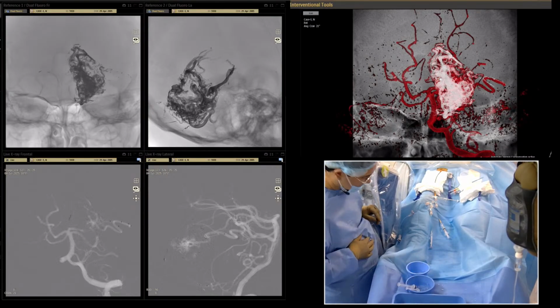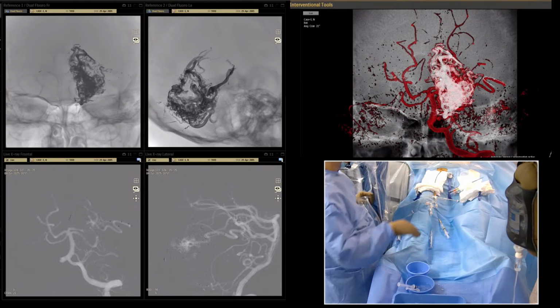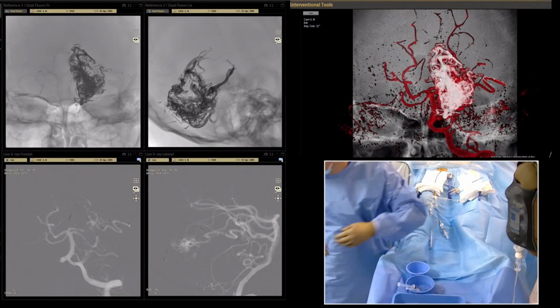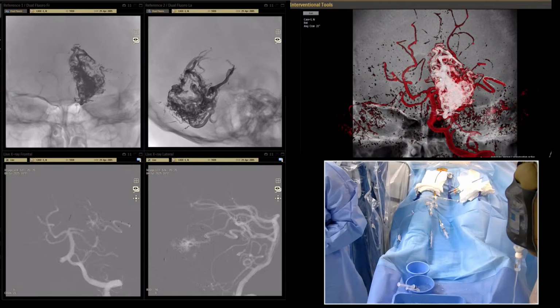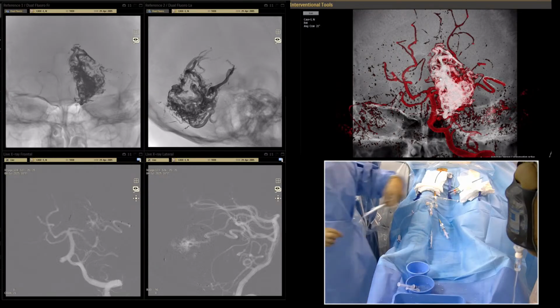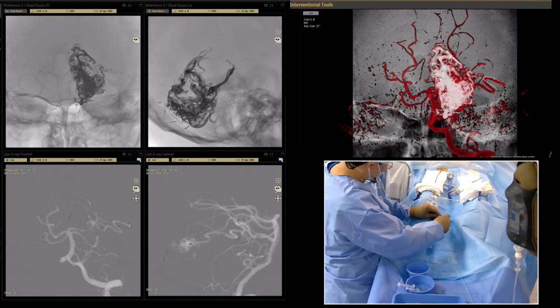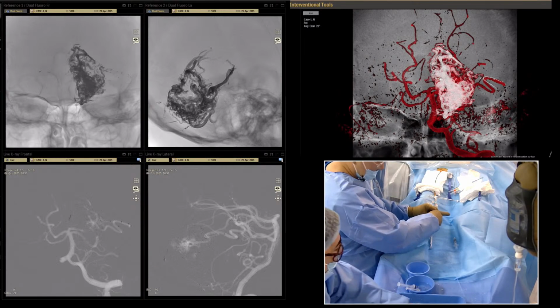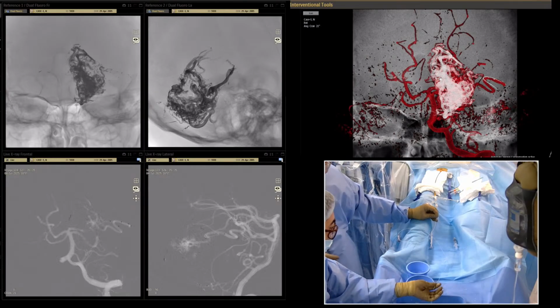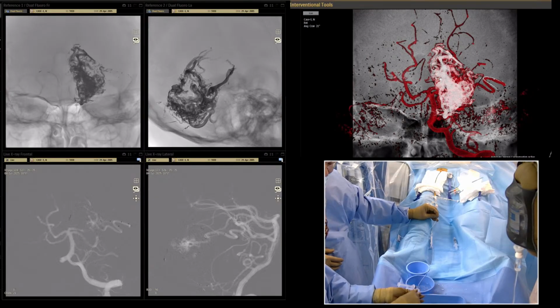Okay. We asked for Hyperform 3D, Hypersoft 3D, yes. 1.5 by 4. It's the best coil. We have another best coil, Optima, and also Vallabi is the best coil. Penumbra coils are best.